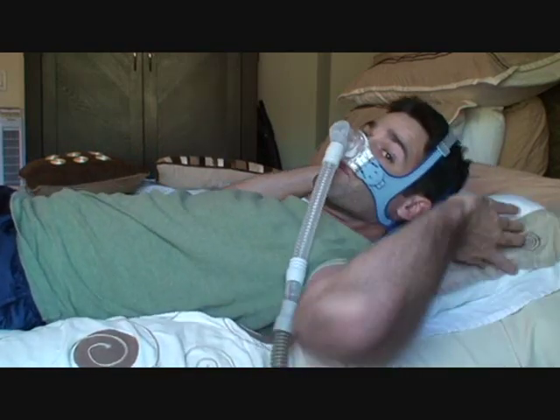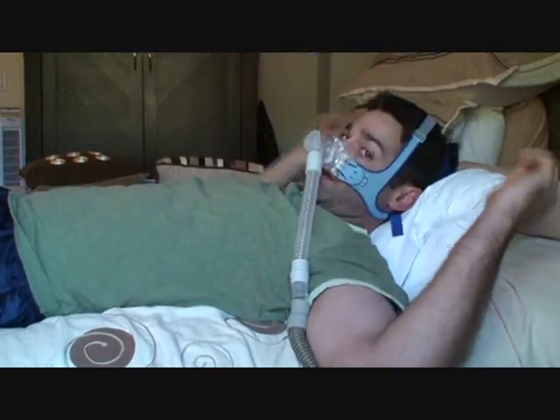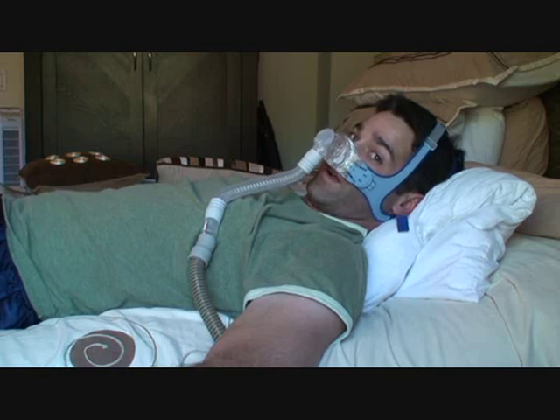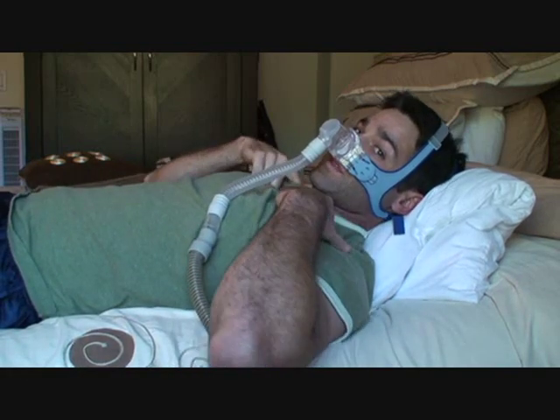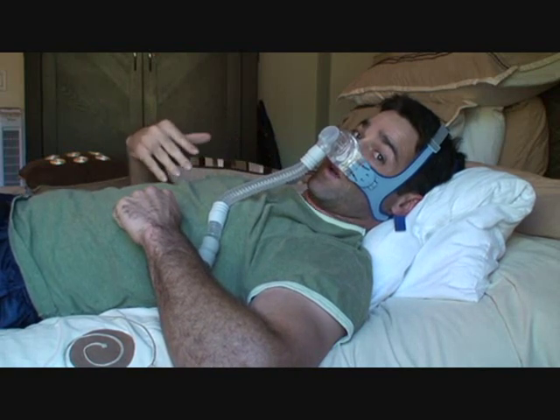So the easy fix is to take your pillow, fold it in half, and do your best to sleep with your head at a 45 degree angle. What this does is it blocks off the opening end of the stomach and makes it more likely for the air to go into the trachea or into the lungs.